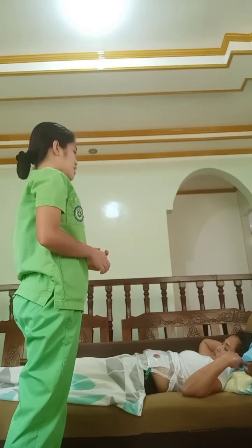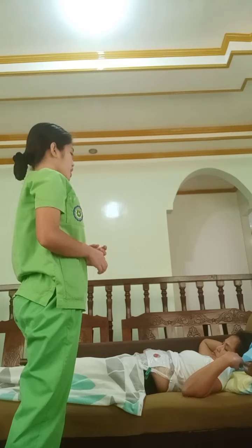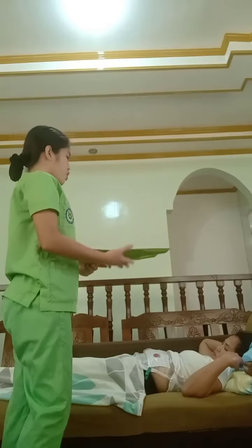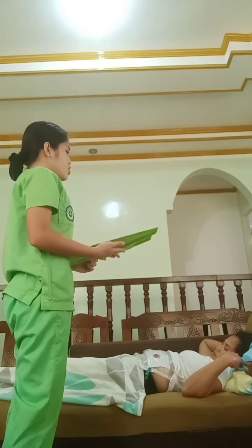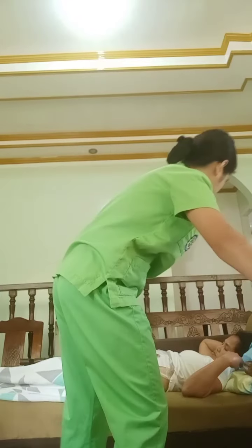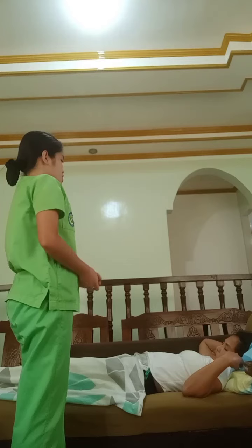If there are any abnormal deviations, we must not forget to notify the appropriate healthcare providers as well as to document onto the nurse's notes the type of pouch and the skin barrier used. So this procedure is what we call colostomy care. So that's it.